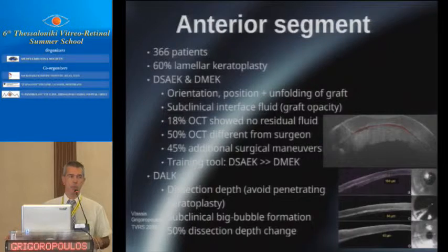It was very useful to train young surgeons to start doing the procedure because they could see with the OCT where the flap was. And also it was very good for surgeons who want to go from DSEK to DMEK, also to do the transition much easier by using the OCT.